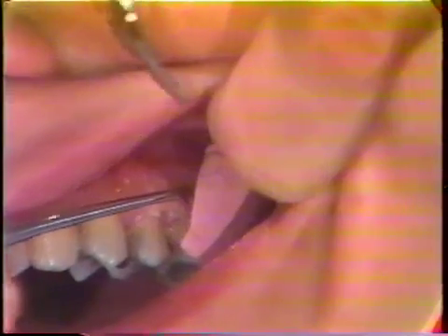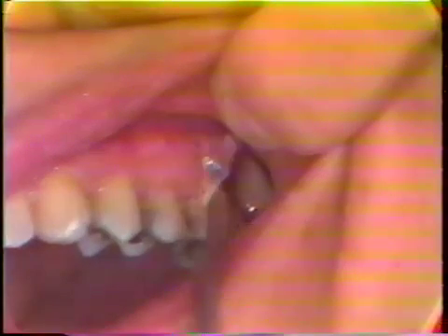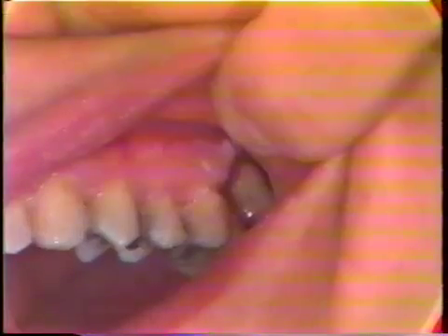It's coming out and away, and the assistant will take hold of the dressing material. I'll make sure it's loose at the distal portion, and you can see how the whole dressing material comes out. In this case, it came out in one solid piece from the buccal surface. Notice that there is some white material underneath that dressing. I'll move some of this off the gingival tissue with the scaler, very gently, to show what's underneath. This is very common to see after a dressing has been in place for six days.